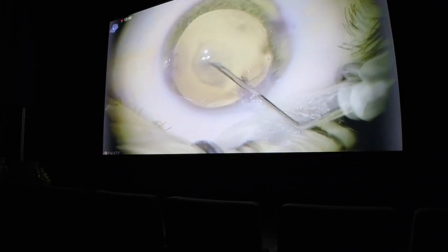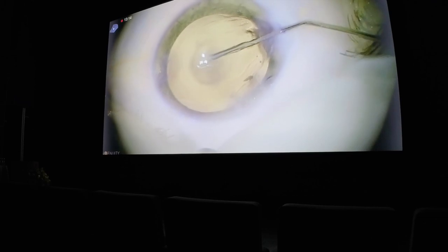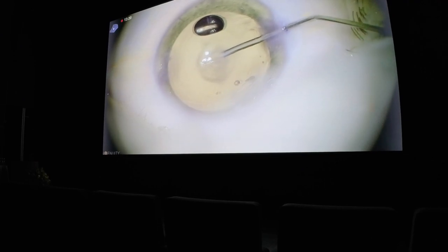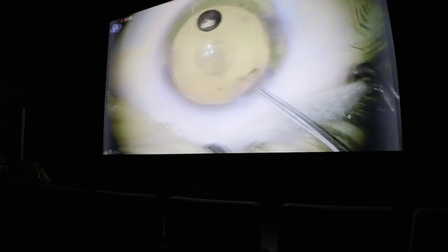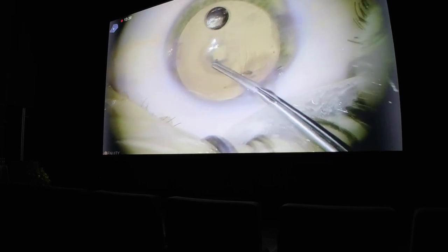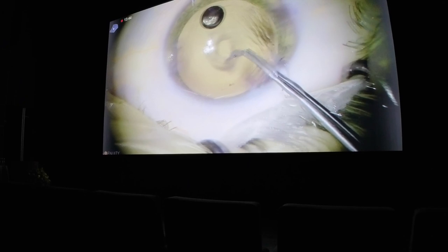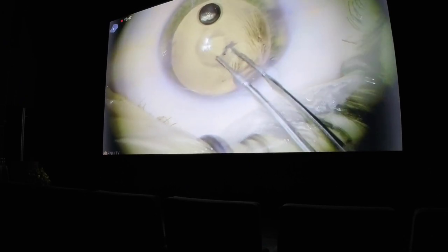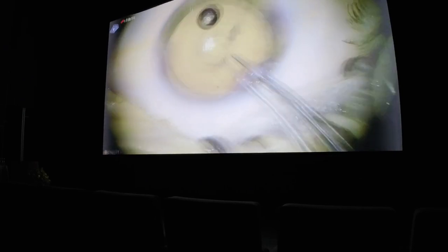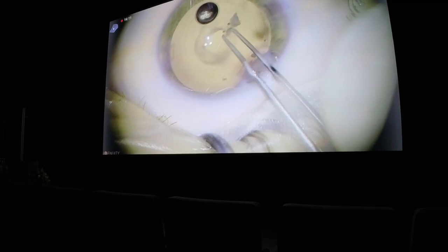Here is a case on which I will perform posterior capsule rhexis. It is completely doable heads-up, but of course there is a learning curve. You can see the wrinkles of the cornea in focus and also the posterior capsule, which is roughly 5 to 6 mm behind the surface of the cornea. This means we have increased depth of field with maintained resolution — which is the definition of depth resolution.